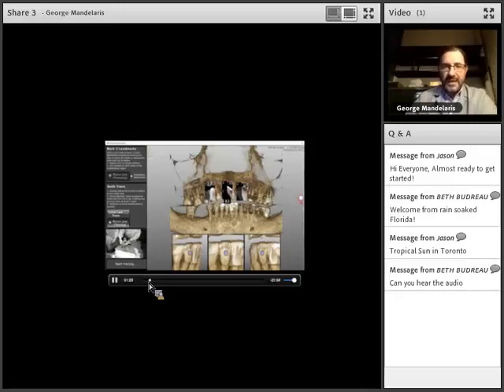You can see that, again, contact mapping. She's moving the tooth around. And it doesn't just have to be that tooth. It can be adjacent teeth as well, directly adjacent to that tooth. Basically, you want to get 100 points that have been mapped by contact. So here's the third and final tooth.